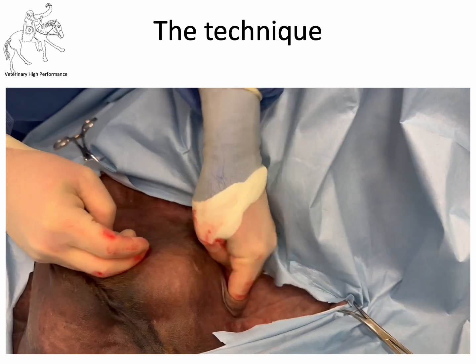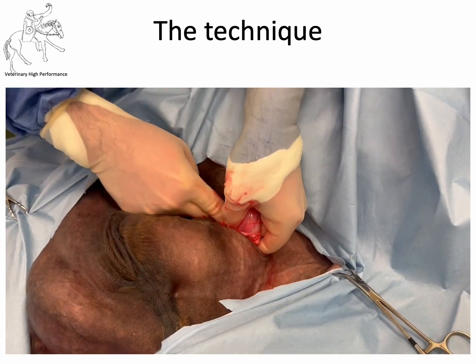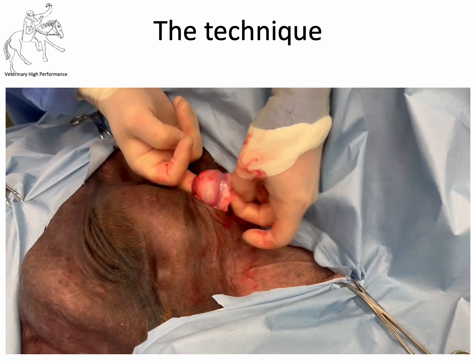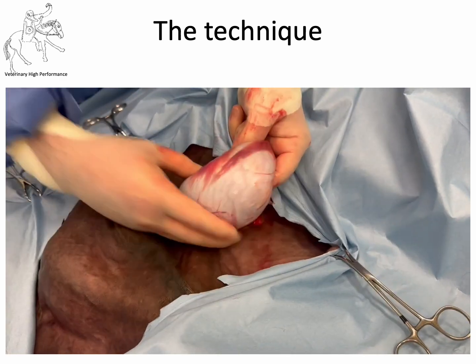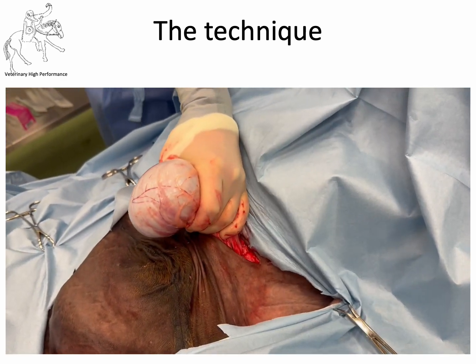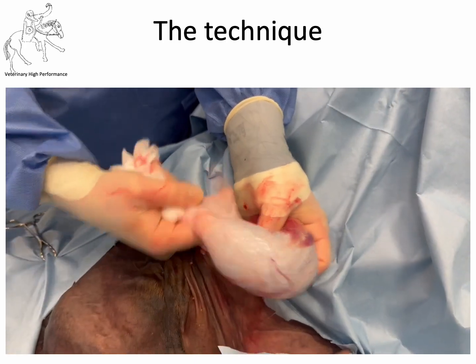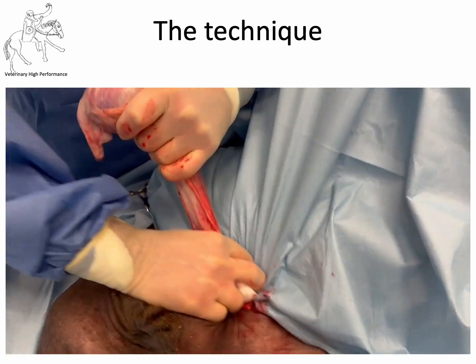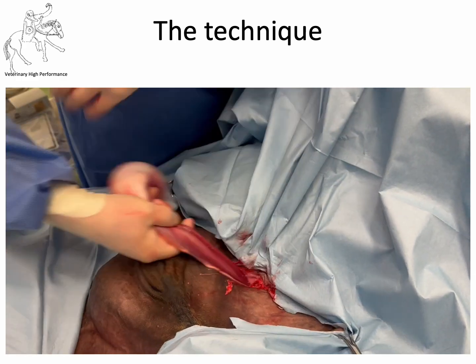Once you've exposed the cord, hook it with one or two fingers — just as you can see being done there. You can digitally perforate the soft tissue, and then use pressure to pull the testicle out of the scrotum. Sometimes a little squeezing will help pull that testicle through nicely. We then take some dry gauze and use it to push away the subcutaneous tissue, digitally perforate and break the pre-scrotal ligament, and dissect away all soft tissue attached to the cremaster and the cord.